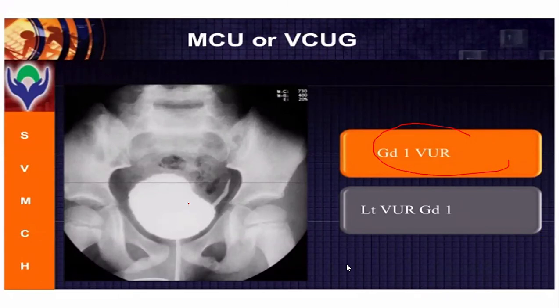So you say okay, you urinate, but when the patient urinates, you have your camera ready and shoot immediately. But what you see is only the ureter, and you did not see dye in the kidney. So what stage is that? That is stage 1. The significance is that, wow, very good, the child still has a chance for spontaneous resolution.